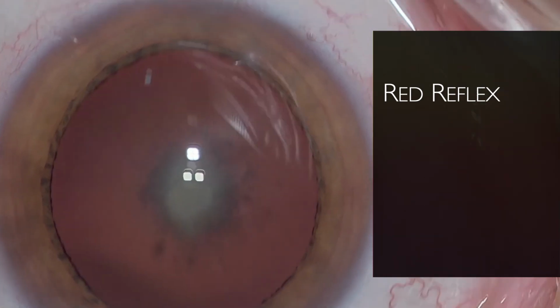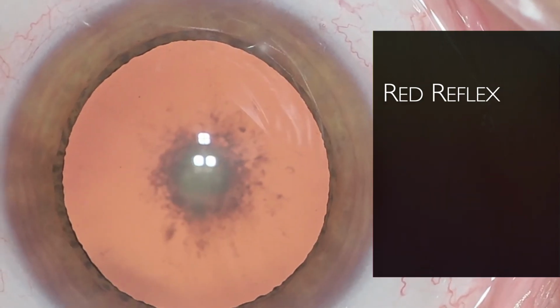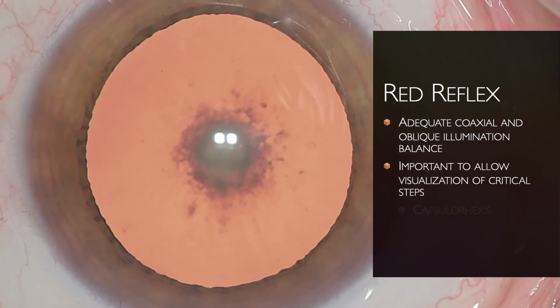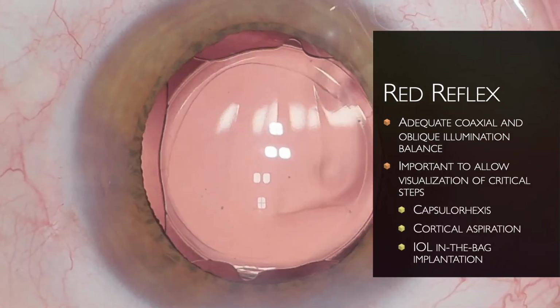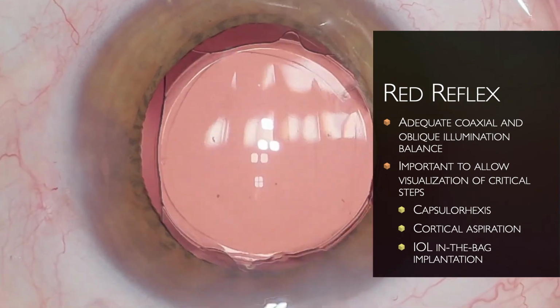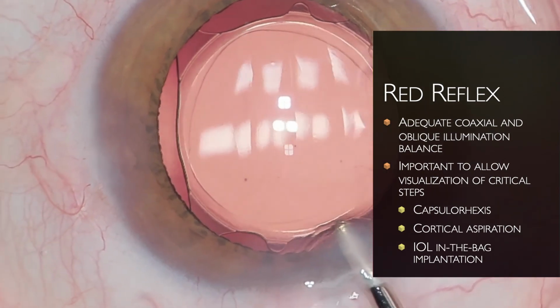Coaxial illumination was one of the most important improvements on the ophthalmic operating microscope. An adequate red reflex is of paramount importance to an easier and safer surgery and for recording requirements also. The surgeon must know how to properly adjust the microscope illumination settings to obtain the best image during surgery.